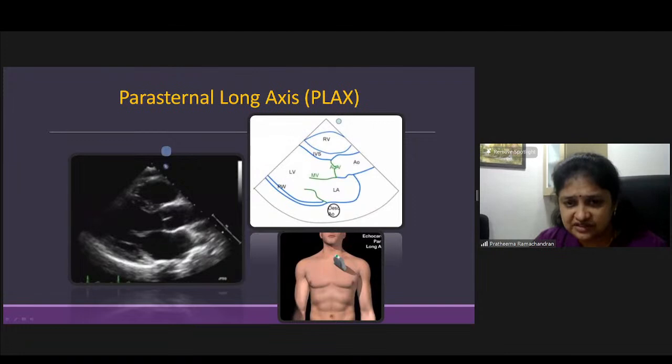So we all know that the left ventricle will contract to eject blood through this. So if we measure the velocity and how much the aortic valve is opening and how much blood is ejected through the aorta, we can find out the cardiac output. It is literally in proper English, only that we are measuring in this view. And we can see the contractility.